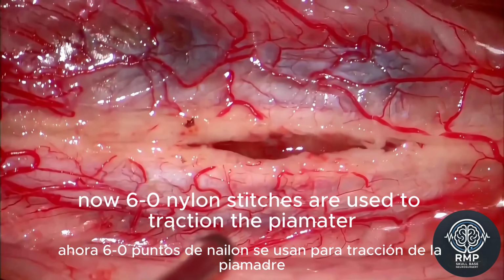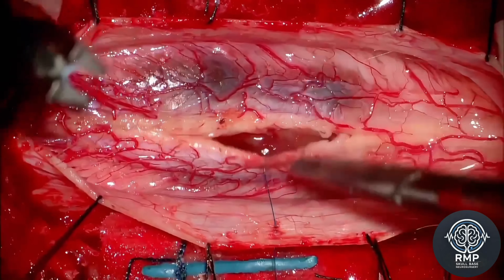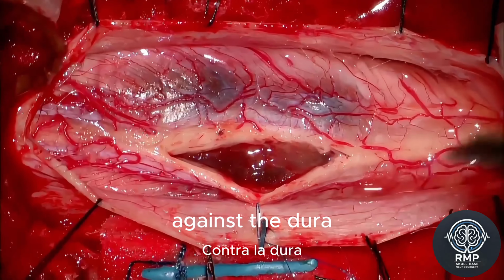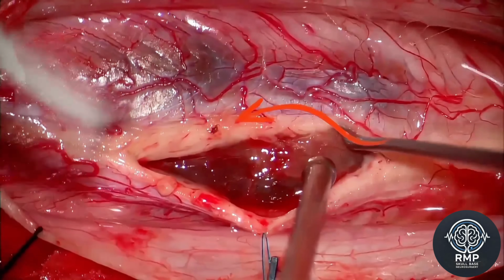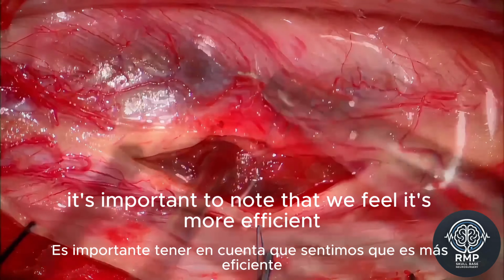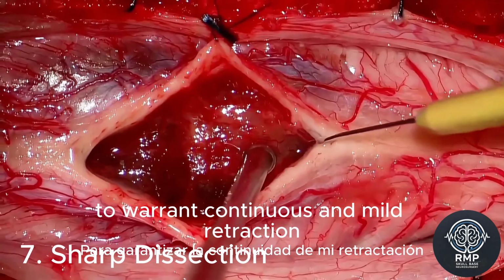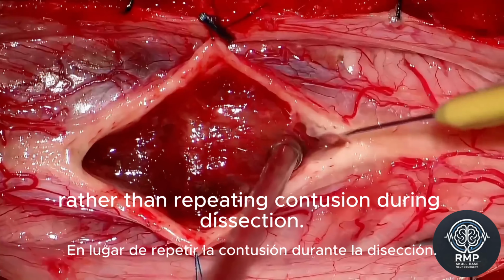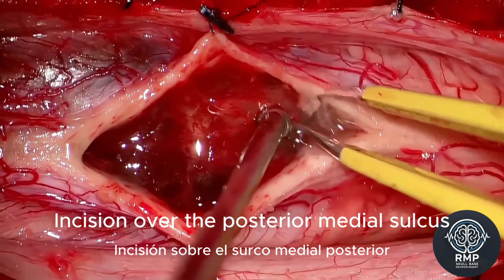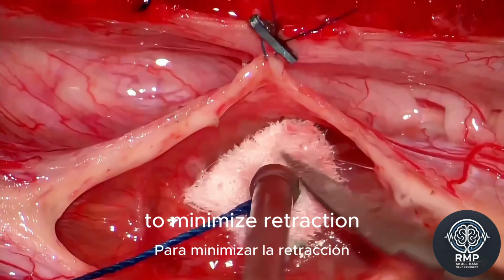Now, 6-0 nylon stitches are used to traction the pia gently and laterally to avoid manipulation. Vascular clips are applied to tack the pia against the dura. Now the process is repeated on the contralateral side. It's important to note that we feel it's more efficient and safer for the patient to provide continuous and mild retraction rather than repeated contusion during dissection. The incision over the posterior median sulcus needs to be extended beyond the superior and inferior tumor margins to minimize retraction.